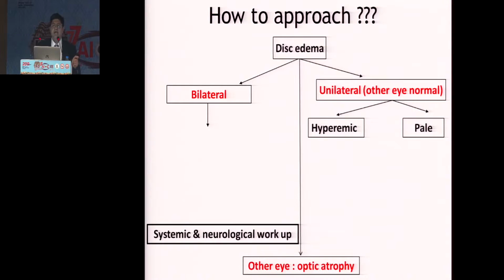And actually, I changed my presentation a little because I thought imaging always gives a sense of neuroimaging and imaging of the brain, which of course we as neuro-ophthalmologists must learn to interpret. But we are often dependent upon the radiologist, and in the end it's always a joint decision of understanding what the imaging is showing, because they need the clinical input from us and we need the subtle signs, and with them we need to guide where we are going to look for the problems that we are searching for. So I'll tell you about a new form of imaging which thankfully is the realm of ophthalmologists in neuro-ophthalmology. But before that, we'll just talk about how to approach.